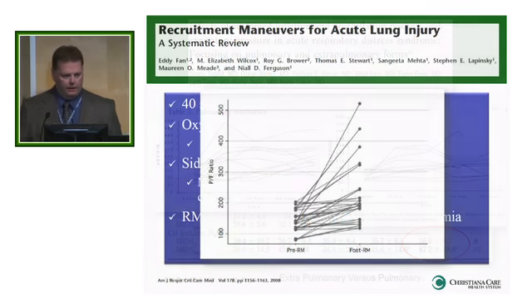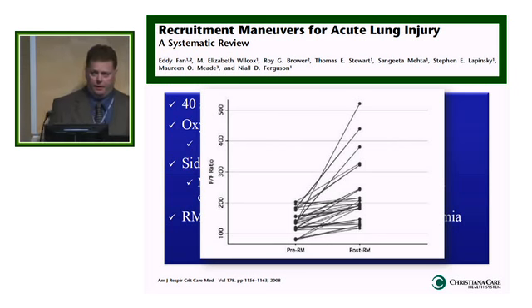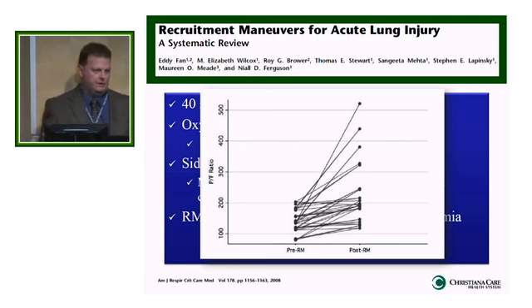And I think, so recruitment maneuvers, this is a systematic review. So there have been a lot of studies out there on different types of recruitment maneuvers, and even very stringent, just the one sustained type pressure that I opened up, saying that's sort of the traditional recruitment maneuver. And when you do the systematic review, they found 40 studies, over 1,000 patients, and what they found is similar to what I've told you.